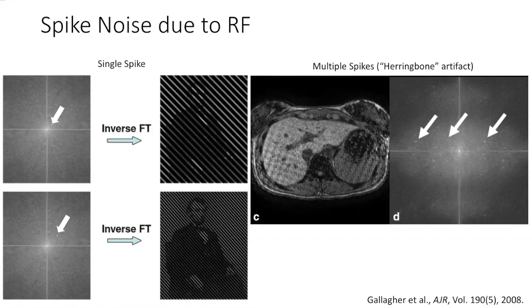This question was, are these K-space images in log 10 scale? Or log scale? No, I don't think these are log scale. I think it's just you have this very bright pixel that certainly stands out, that creates this artifact.